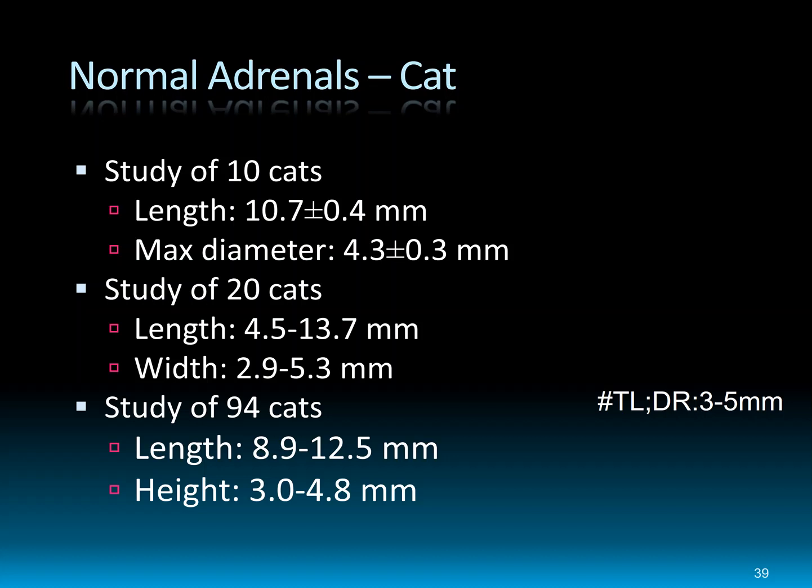I really don't want to see a cat more than 5 millimeters for its adrenal gland. Once it gets bigger than that, then I'd be concerned again that it was too large and there's something going on. So that's lots of numbers. There's your too long, didn't read: 3 to 5 millimeters. Next slide.